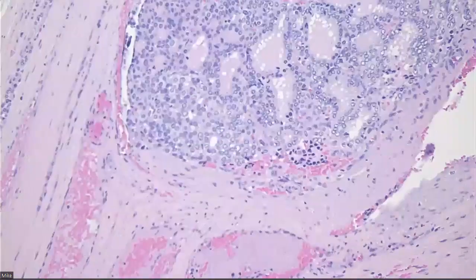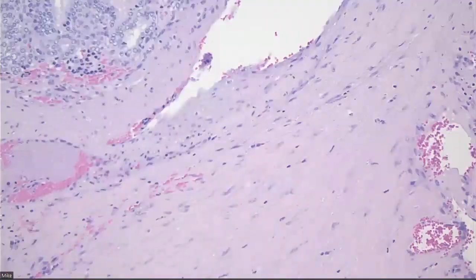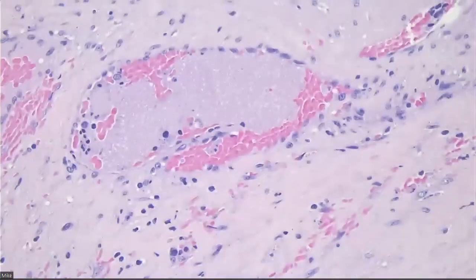Lymphatic invasion tends to be small vessel, tends to be classic PTC. Angio tends to be large vessels in and around the capsule. Sometimes you can see a muscular wall. Maybe arguably there's a hair of a muscular thing there. And it tends to have thrombosis, fibrin thrombi, and adherence to the wall with fibrosis.